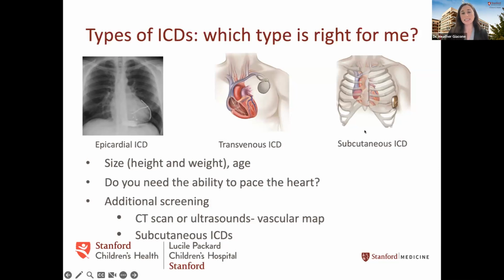The big thing, kind of a hotter topic right now, is patients with hypertrophic cardiomyopathy. Because there's such a big mass of the heart sometimes, what can happen is that relaxation or resetting electrically of the heart can look quite tall. And so sometimes these devices can think it's another impulse and think that this is an abnormal rhythm happening. And I'll talk a little bit about that in a minute.